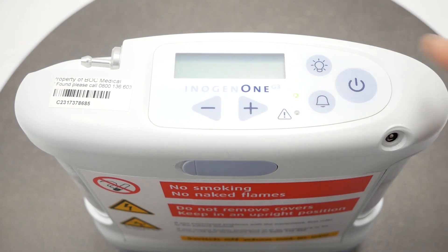The main features of the device are the on-off button. You press the button once to turn the device on and press and hold for one second to turn the device off.